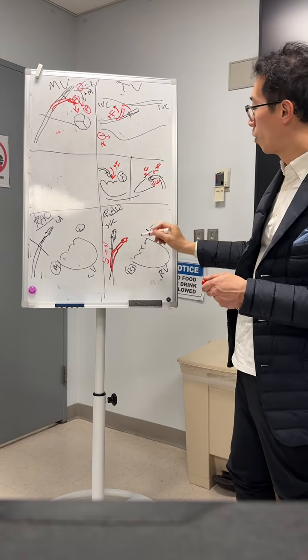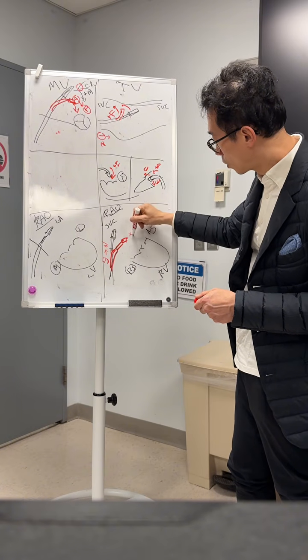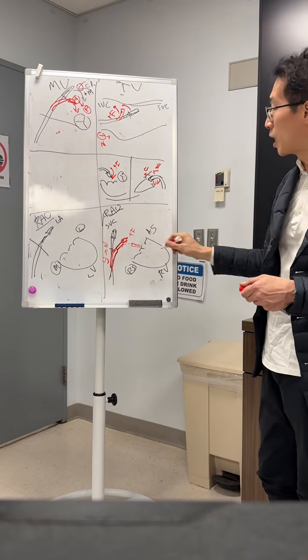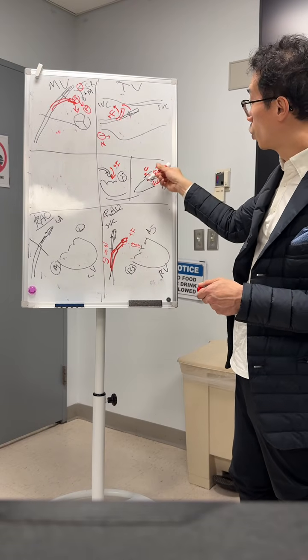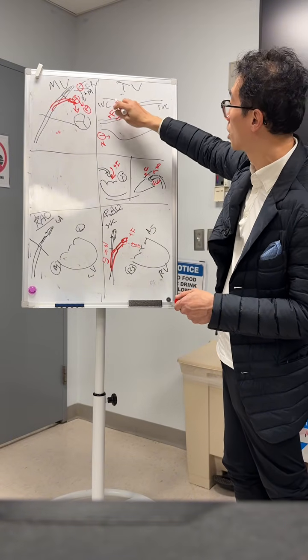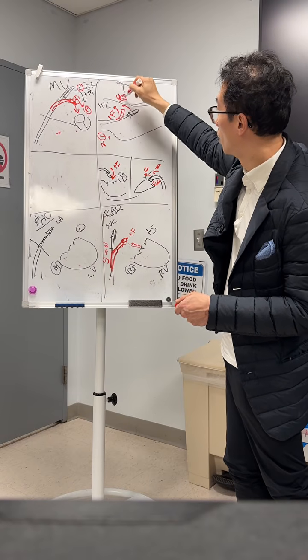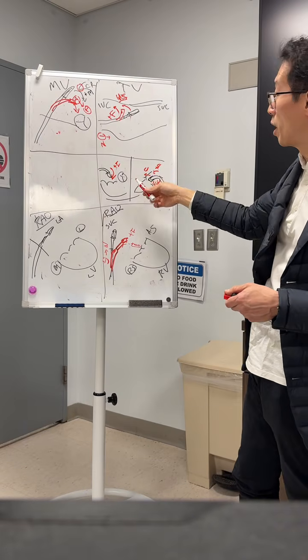Okay, so that's the equivalent, and this is how you know, as I mentioned, when you add flex, this is going to bring you down here. Okay, so that doesn't tell you how septal or lateral you are, remember that, right? You have to use echo to see that. But this allows you to see. So once you clear the septum, right, this is IVC, this is interventricular septum, interatrial septum. Once you clear this, you can ask the imager, let's go to inflow X-plane view, right?